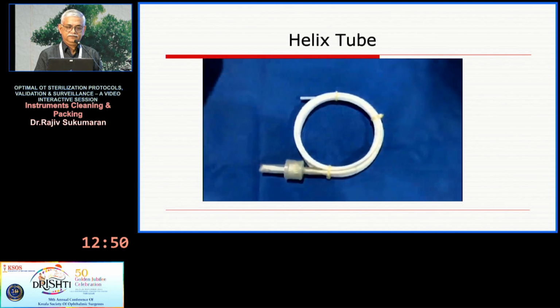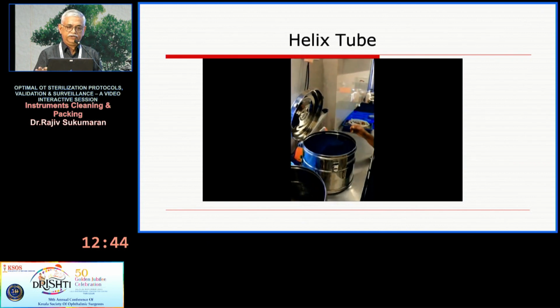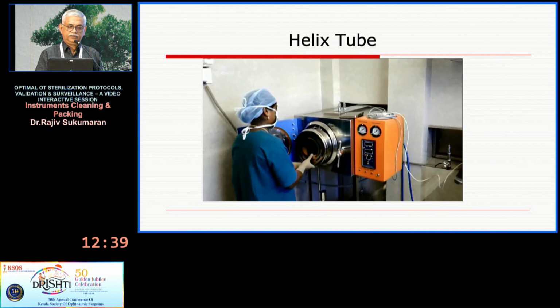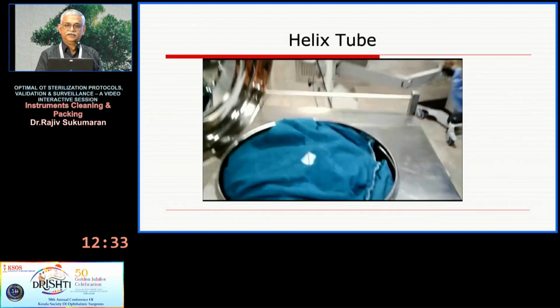And this is placed in between the load that you are doing and checked for autoclaving. This will tell you whether the machine has got a good vacuum cycle.